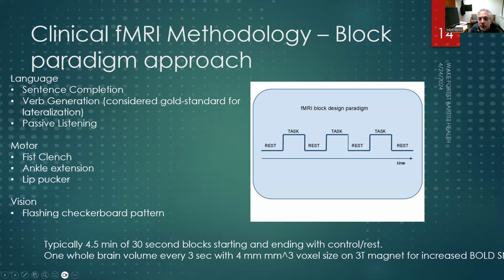So sometimes what'll happen, if you don't know on an fMRI where their language is, they'll often do a surgery where in the OR, they'll open up the skull and wake the patient up in the operating room, which is a big surgery with the patient awake, and they'll actually electrically stimulate portions of the brain while the patient performs a language task. And it's a much more direct measure of the spatial localization of language in their brain. Because you're using a stimulus electrode, you are directly stimulating neurons rather than using a non-invasive perfusion metric.